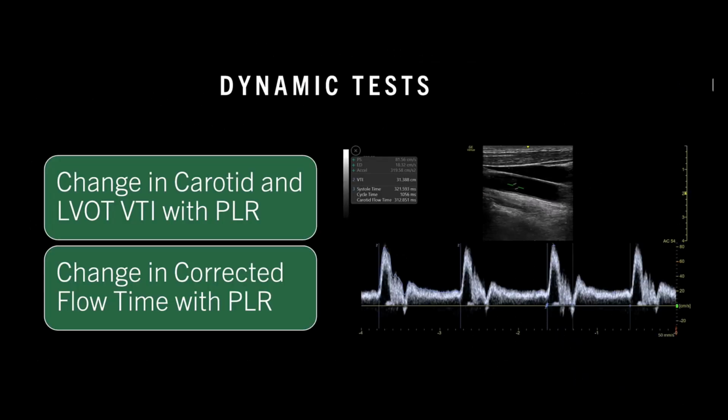So getting into more of the meat and potatoes of our lecture today, the dynamic tests. These are some of the core tests we're going to cover.